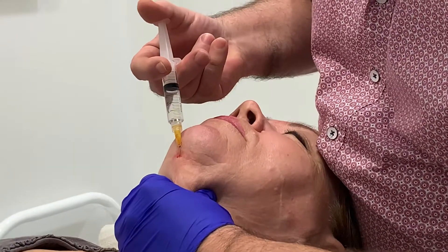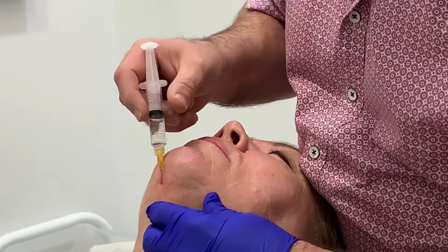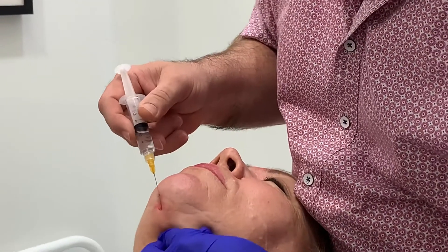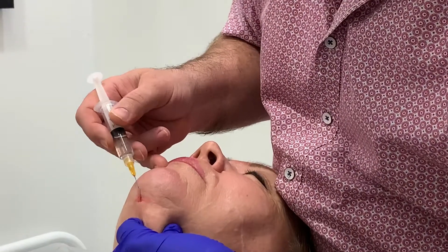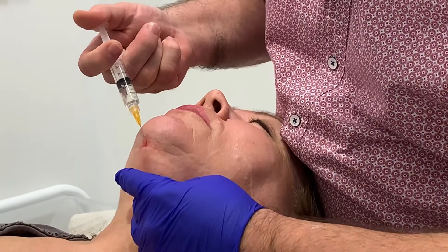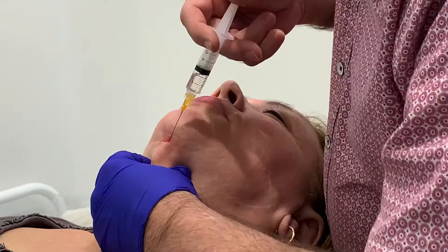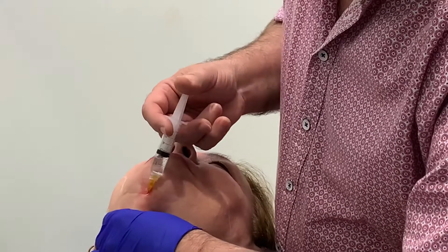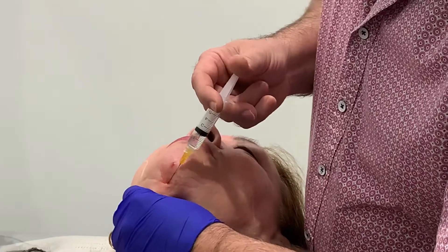I'm not going to be doing any deep subplatysmal fat. I'm just going to be injecting into the superficial fat plane here. Very easy to put the cannula through. Is it painful? No, not at all. There's no pain at all and we're just basically injecting through here with our product, and then I'm going to come to this side here. I can feel the tissue as I go, so I really don't want to be putting product in areas where I can't feel any fatty tissue.